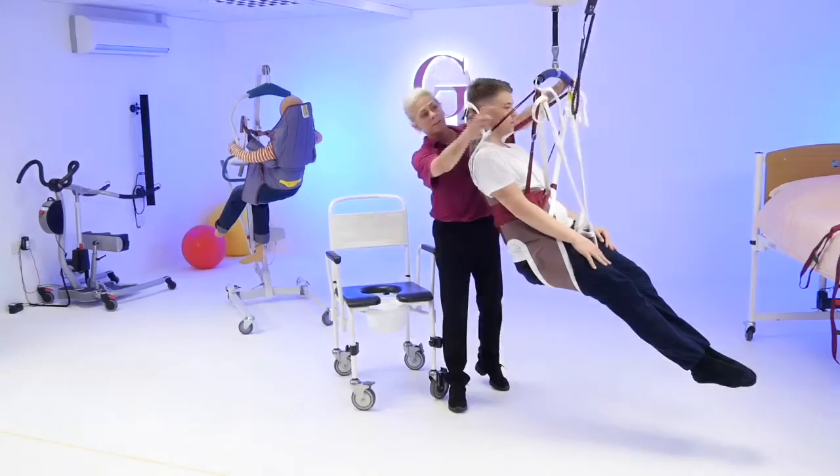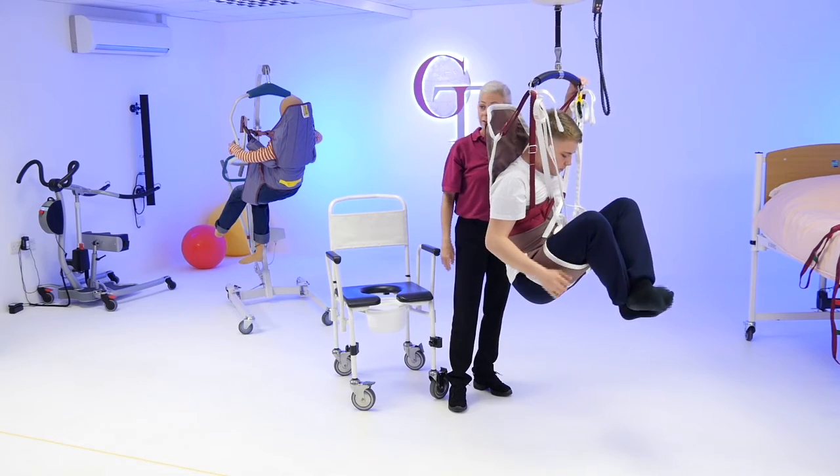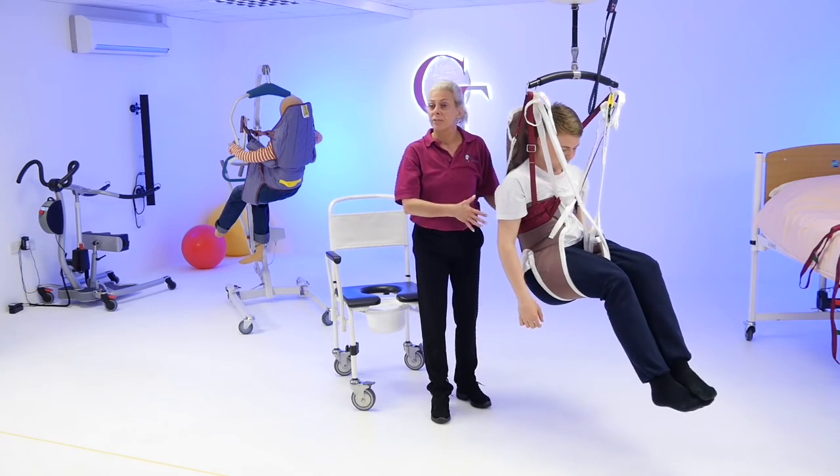If it's too tight, you loosen off this thoracic band here. This flows freely, and if you can bring your knees up to your hip, it's not going to fall through because it's such a good fit.